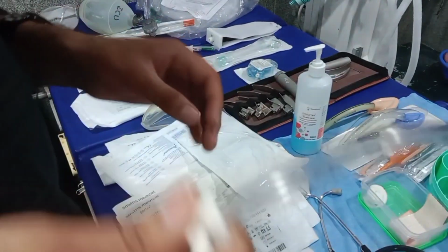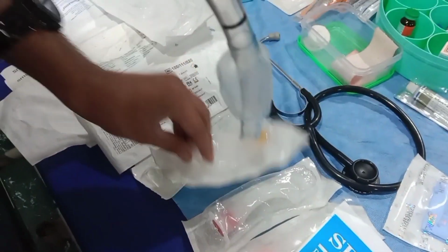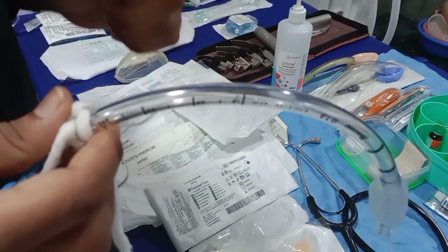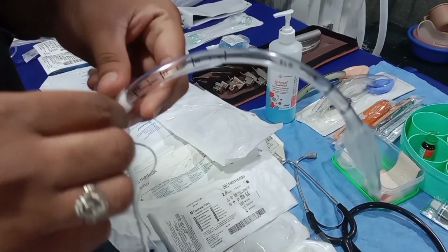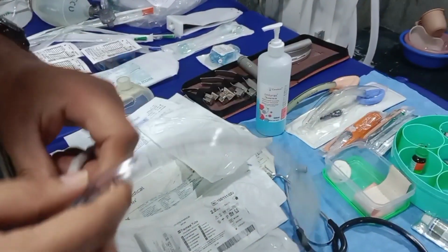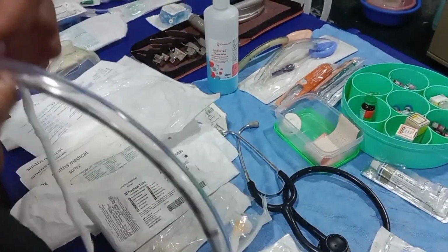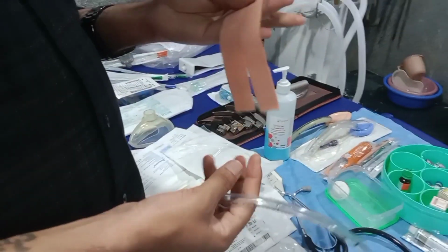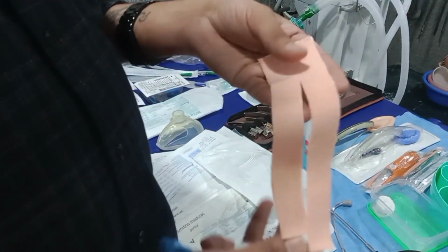After putting the tube and after tying this, we should put the airway. So we should open the airway and put it inside the mouth, so that it prevents the patient from biting the tube. Again you can do suction also. If there are any secretions or any fluid inside the tube, you can do suction from here. Once the mouthpiece and airway are placed, you can fix the tube using the knots and the dynaplast. And you should make sure that the dynaplast is cut in 2 or 3 pieces in this pattern.